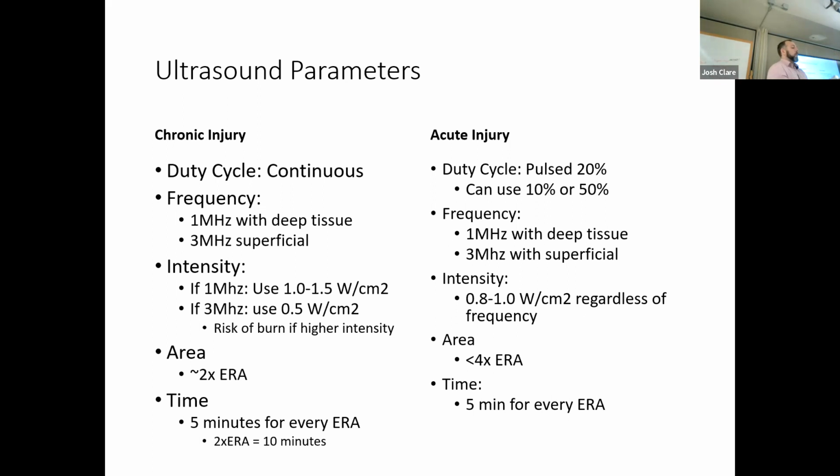So if we took a tape measure and said this is 4 centimeters across, I have an 8 centimeter circle I could effectively have a thermal effect for. If I go further than that, I'm not generating enough heat in the tissue. Just like if we were to slide that hot pack around. That's all we're doing here, sliding the hot pack around or moving the diathermy machine. No, we want this area to be heated up.